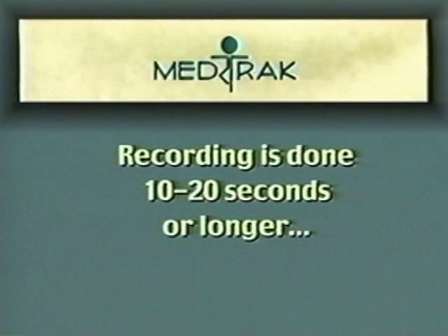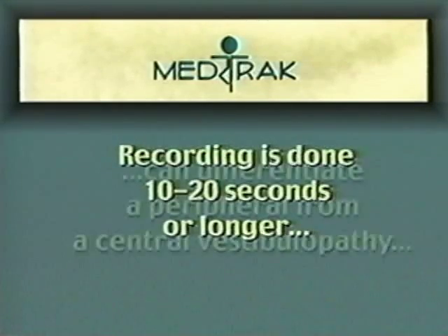Typically, these are static positions with slow changes, and there are up to or over 20 possible positions. However, the aforementioned positions are typically those that are most commonly employed. Recording is done for some 10 to 20 seconds, and certainly longer if symptoms are noted or nystagmus is seen.